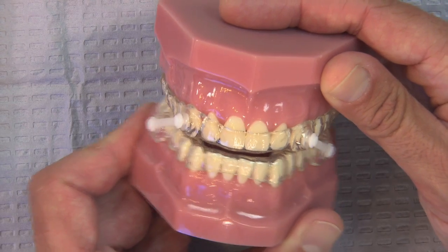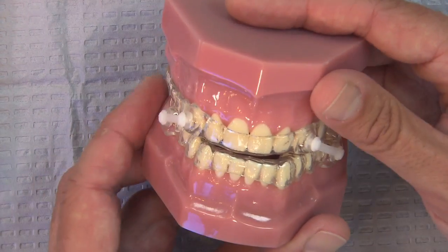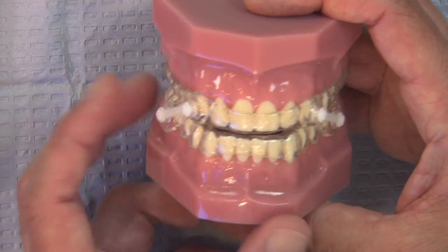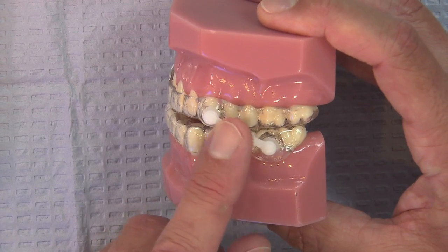Now, it's a pretty comfortable appliance to wear. You can see the patient has some ability to move side to side, although the stiffness of the connectors does limit that somewhat. They're able to open and close a little bit, so it's a less claustrophobic feeling. So it's always been a very comfortable appliance for the patient, but one of the downsides was the connectors and the straps.